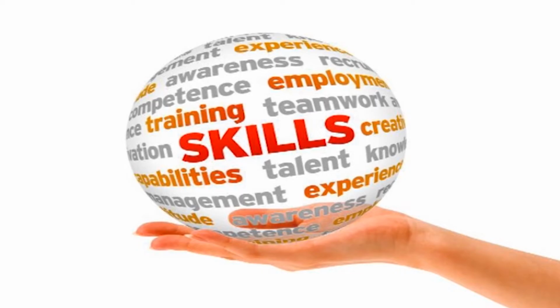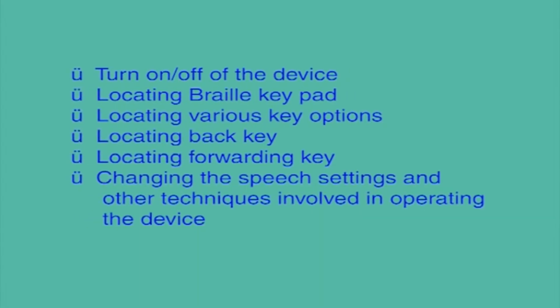The skills needed to use electronic devices. For the effective use of electronic devices, it is needed to impart the following skills to students with visual impairment. Turn on/off of the device, locating Braille keypad, locating various key options, locating back key, locating forwarding key, changing the speech settings and other techniques involved in operating the devices.